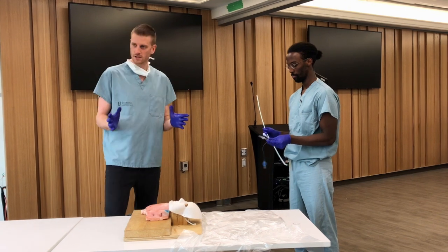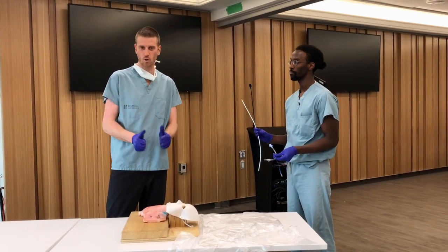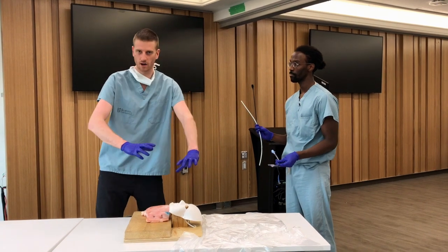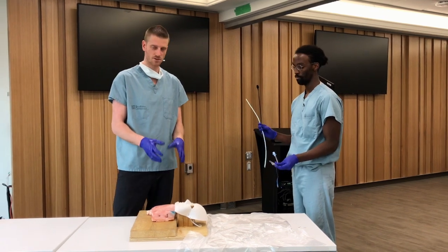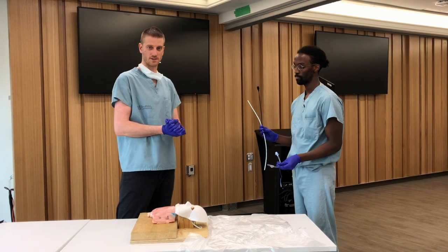When you're doing a surgical cric, it's really a two-person technique, much in the same way that quality bag valve masking is a two-person technique, okay? The reason is you've got a lot going on here as the operator. Prepping a tube is certainly not part of that. You're going to lose your landmarking, you're going to lose your place, okay? So always in your airway plan, make sure you have that person who's going to be your assistant.